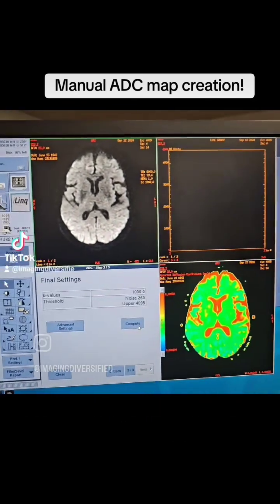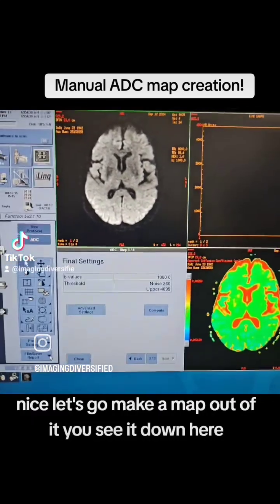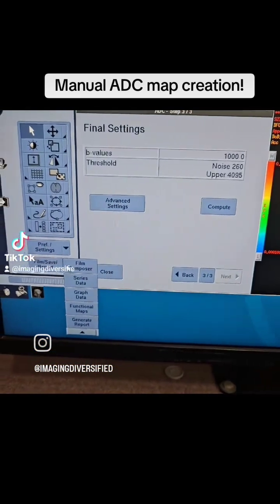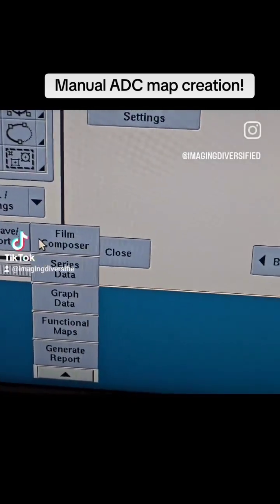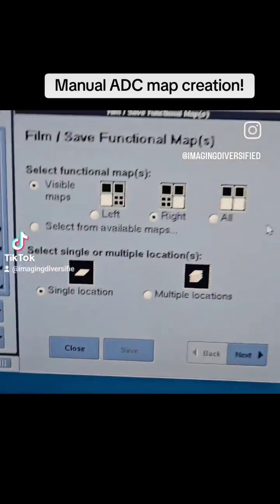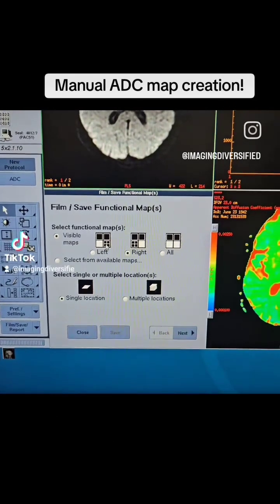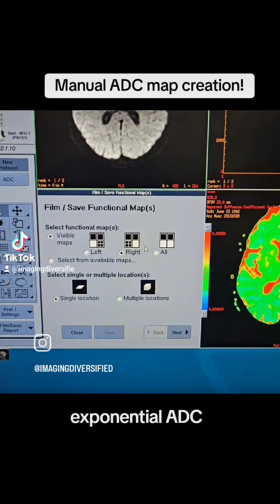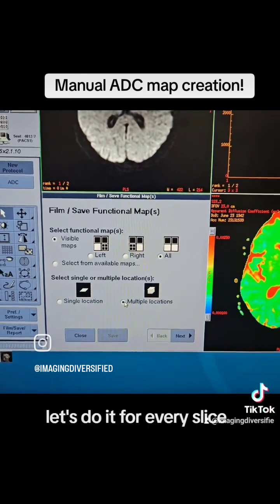Nice. Let's go make a map out of it — you can see it down here. So what kind of map are you going to write? Exponential, ADC — let's do both. Let's do it for every slice.